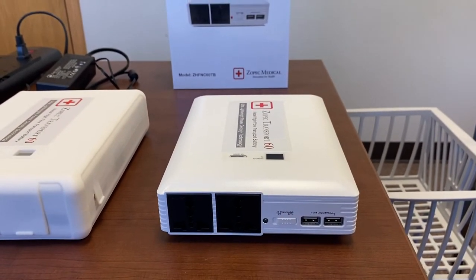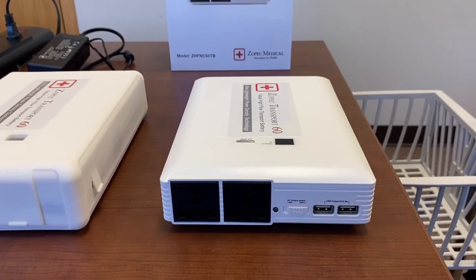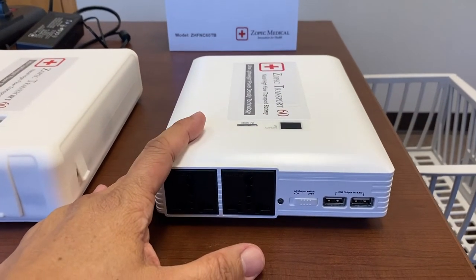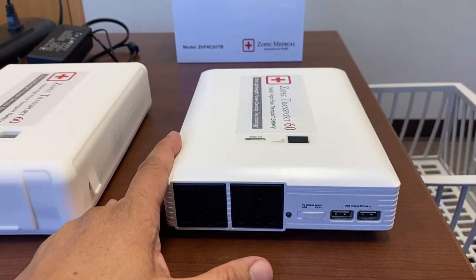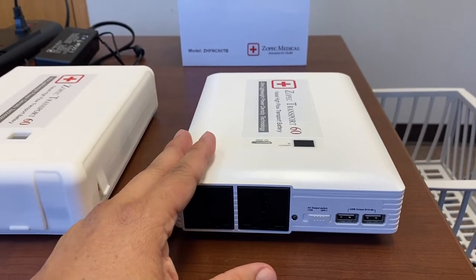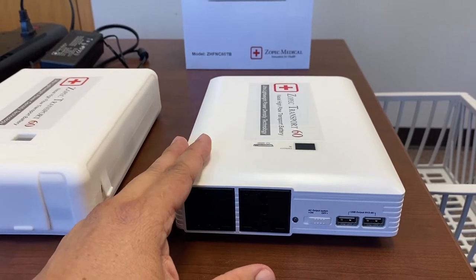It's a transport battery, not a UPS, which means you don't plug it in 24/7 with the nasal high flow machine. You would leave it at a charging station, have it fully charged to 100%, so it's ready for transport, and when you need it you grab it and bring it to the AirVo2 for transport.